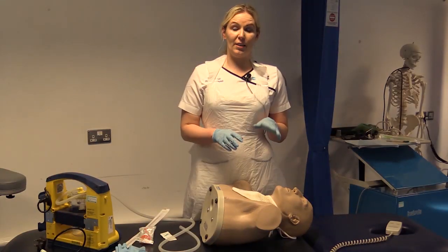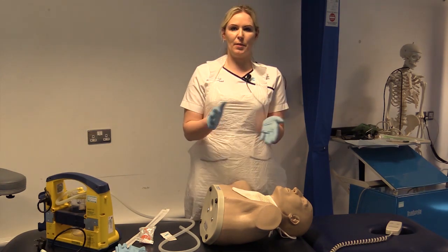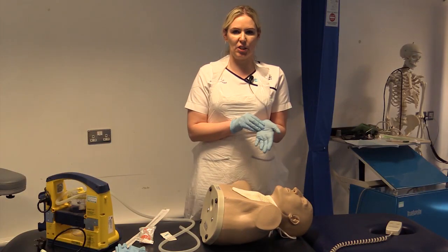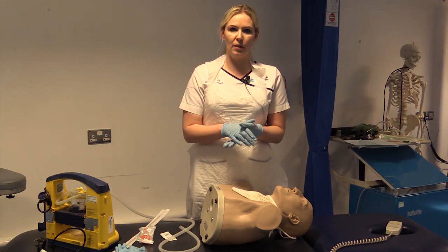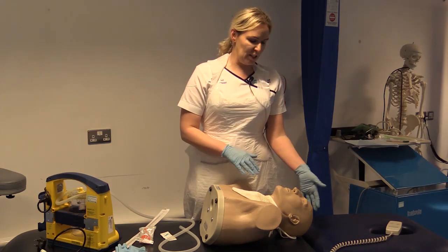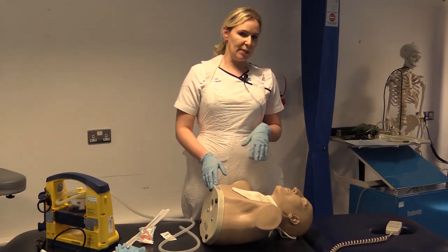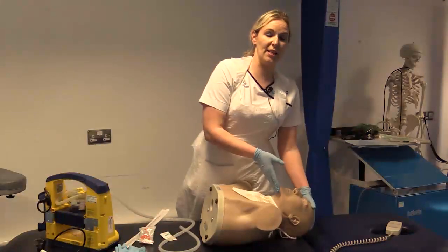This video we're looking at oropharyngeal suction via an oral airway. Okay, so again, same principles apply. You've established your need for suction, you check the patient's medical notes, and you've gained informed consent where possible. You've washed your hands and you've put on your appropriate PPE. So you're going to explain to your patient what you intend to do. You're going to position your patient again so their airway is as open as possible, ideally with the chin tilted up.